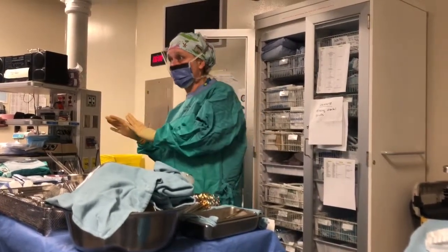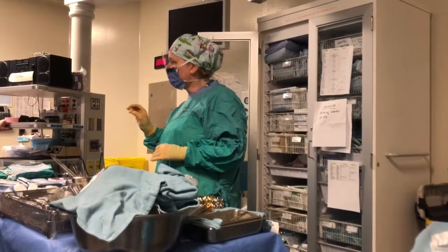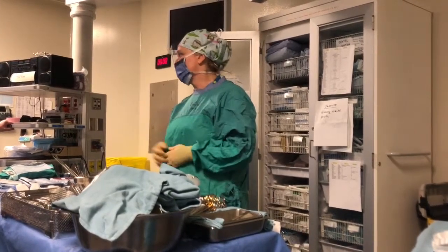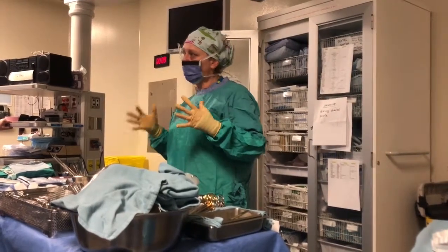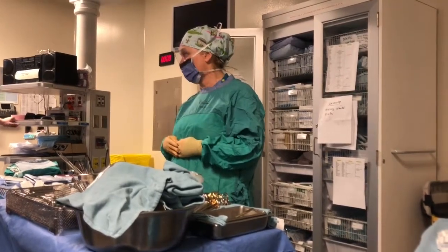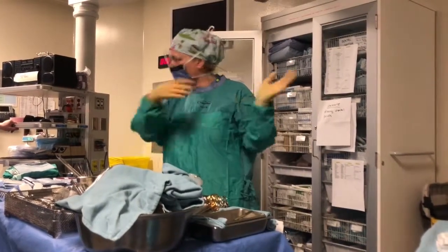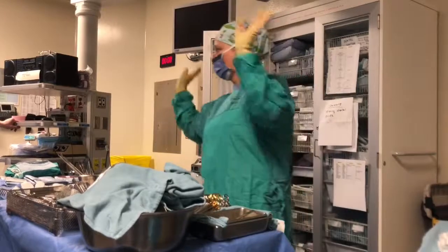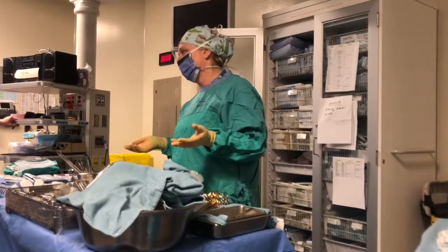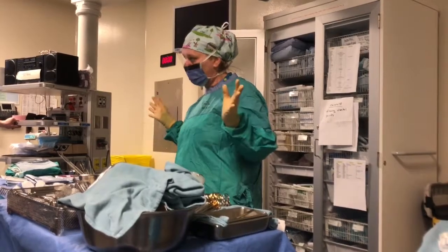We're still going to x-ray the patient, no matter what, because we did not count. We're going to x-ray the patient. But the last thing I really want is this person's been through so much, they're closing up, and there's a sponge in there. So all you have to do is try to do multiples of 5, so that in your mind, you're pretty sure that the sponges are out. But either way, they're going to do an x-ray. But if we don't do multiples of 5, and we just say, well, we'll forget it, and we just clump all our sponges together and not worry about it, well, he closes, there's a sponge inside, we have to open, we have to take them out, right? So that's why, either way, I would just do multiples of 5 and not worry about it.